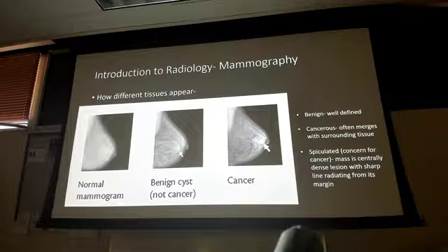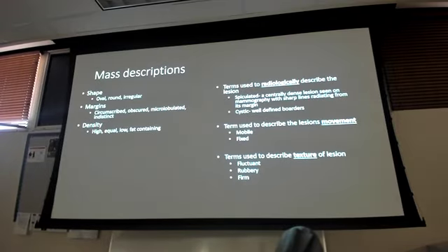So that's the extent of reading these things that I need you to know about. The rest of it is going to be, when do I order it? What type of study do I order based off of the patient presentation, so we order the right thing for the patient, okay? Because mammos are so sensitive when it comes to making sure we get the right read. It's one of the few things where, as a family practice PA, every time I read a mammogram report from the radiologist, I don't even look at the images. I just take the report at its finality, you know?